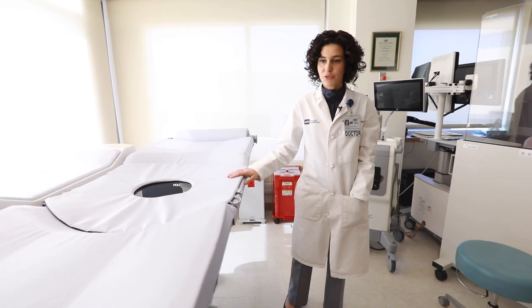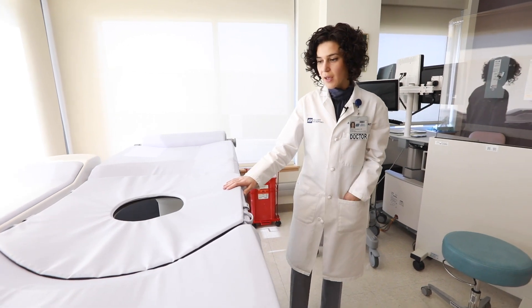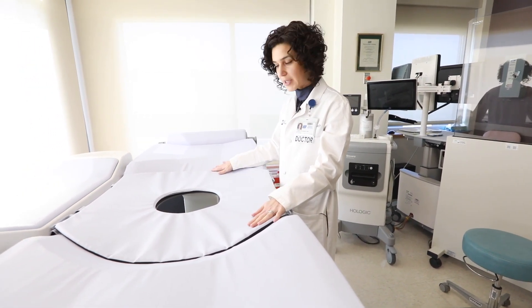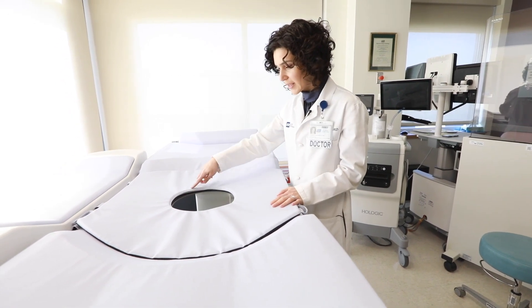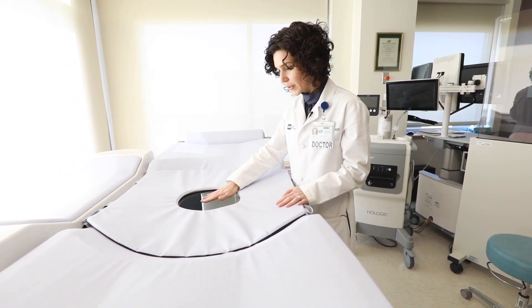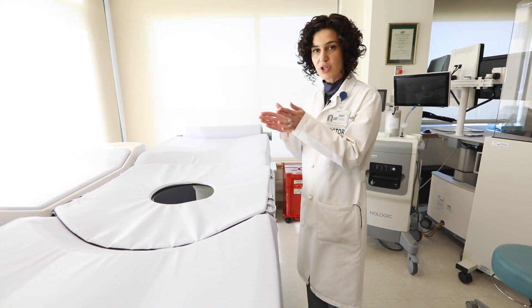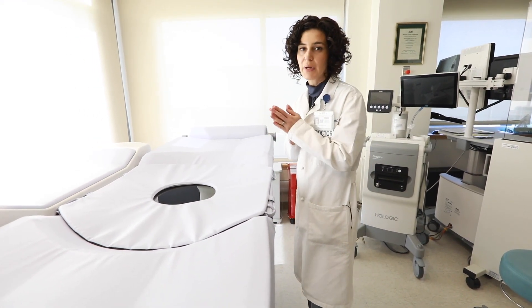This is the table that we use for a stereotactic biopsy. The patient comes in and lies on the table on the stomach, and there is a hole in the table and the breast comes down through the hole. Under the table, the breast is under compression, similar to mammography but not as tight.